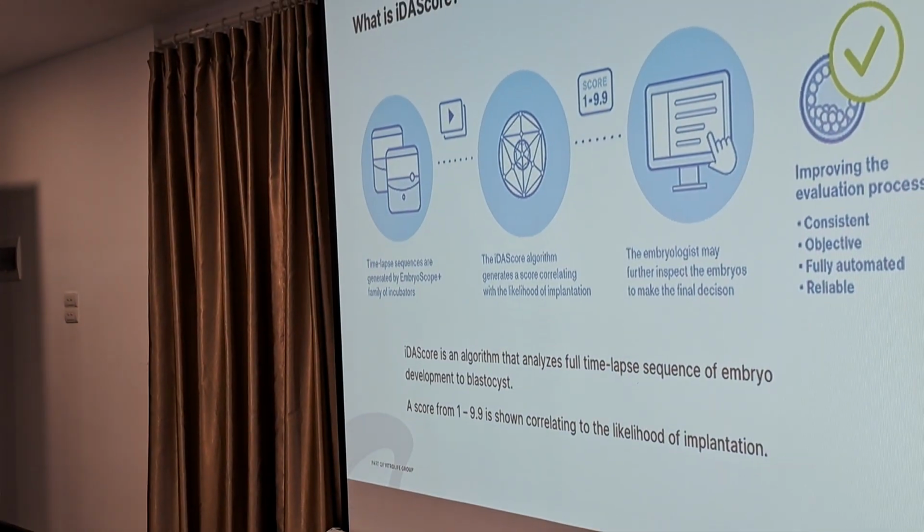It is the algorithm that uses the full time-lapse sequence from day 0 to day 5, and then incorporates that into assessing a score for each embryo ranging from 1 to 9.9.